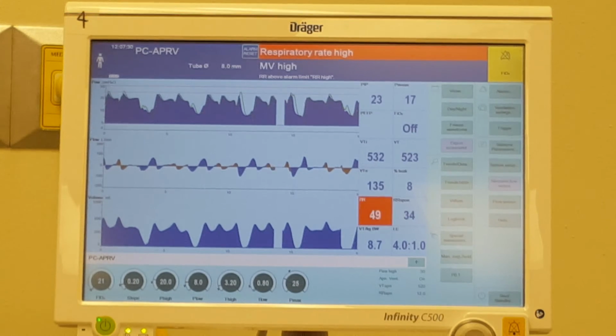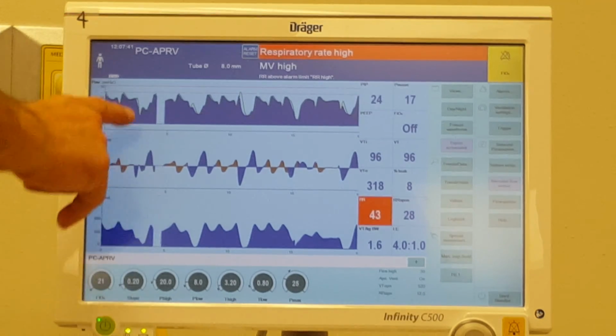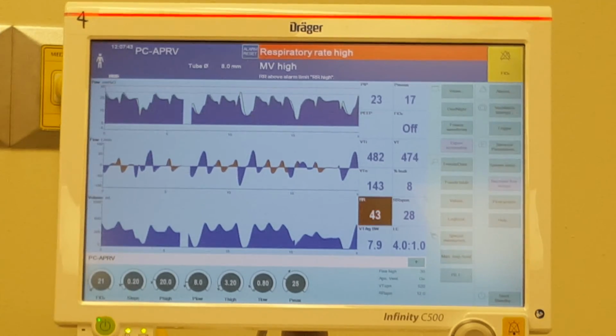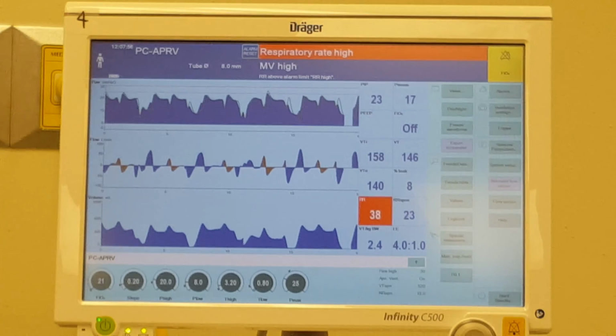Just when the patient breathes out, that recoil causes the pressure to go higher. See there, I'm down to a rate of 30. This one is the running average, but the other one's down to a rate of 30. See the asynchrony there? I'm working hard to get these volumes, 160, 300, but I'm working hard for those volumes. That's the way APRV works on this vent.